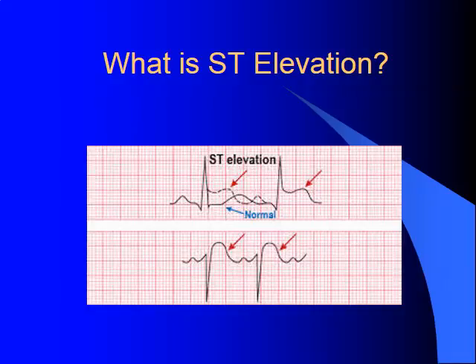But real quick, we are going to talk about what ST elevation is and why we are recognizing it. And then we'll come back in more detail to actually talk about our STEMIs and look at examples after we get through this portion. So the reason that I do teach the STEMI mimic portion before talking about our ST elevation MIs is because so few true STEMIs are actually seen by us.